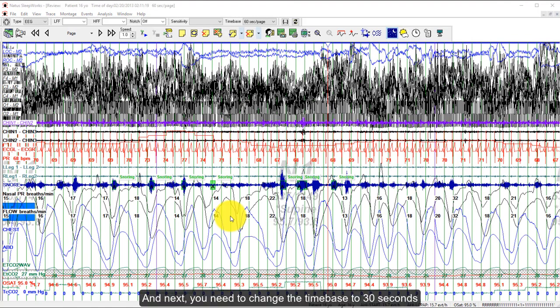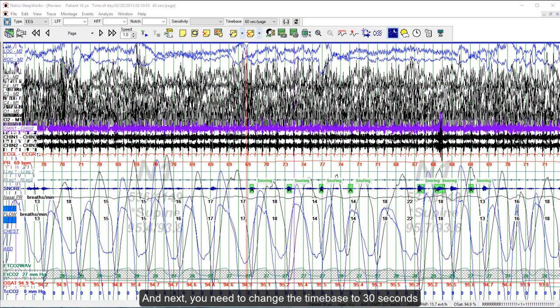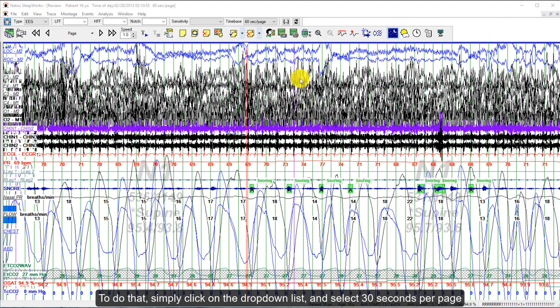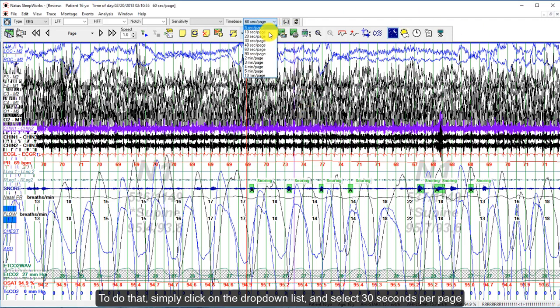Next, you need to change the time base to 30 seconds. To do that, simply click on the drop-down list here and select 30 seconds per page.